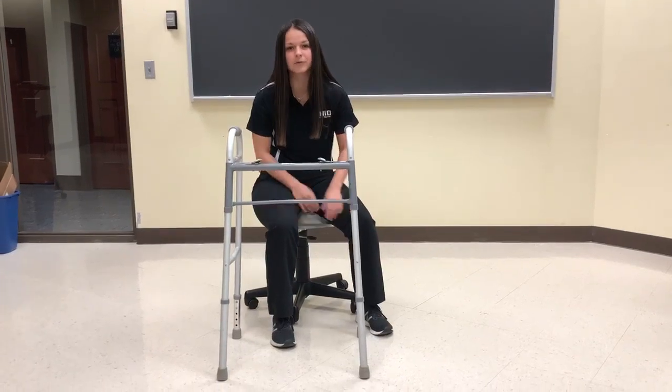To begin, I'm going to be describing the differences between standard, rolling, and platform walkers. The first walker I have here is the standard walker. Its most distinguishable characteristic is that each of its 4 legs have rubber tips at the bottom. It's most commonly used for patients who need to bear a substantial amount of weight, and it's also nice because it's easily collapsible. However, because the patient has to pick up the walker with each step, it increases their likelihood of falls and slows them down.